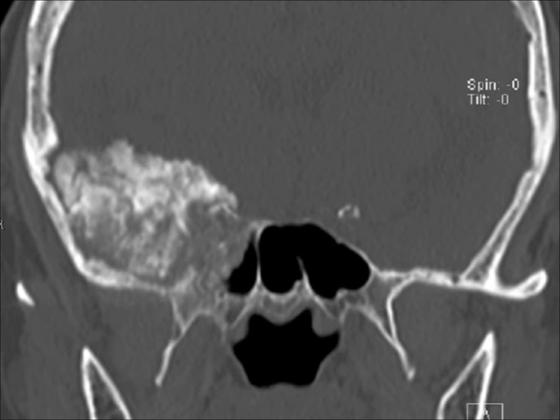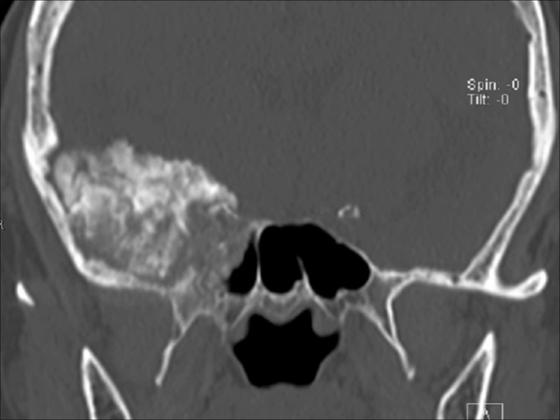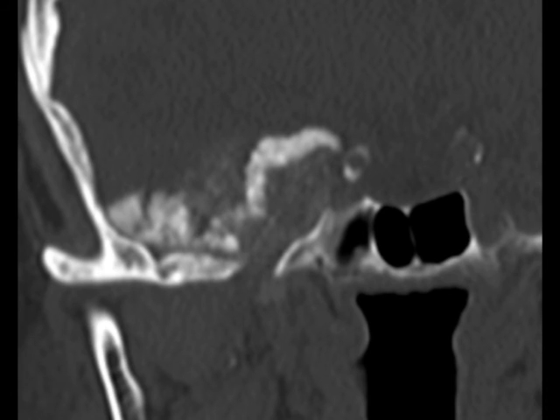Meningiomas are the most common primary intracranial tumor, are more common in females, usually appear hyperdense on CT, and may calcify. They usually avidly enhance and can have reactive hyperostosis of the adjacent calvarium, as seen here.